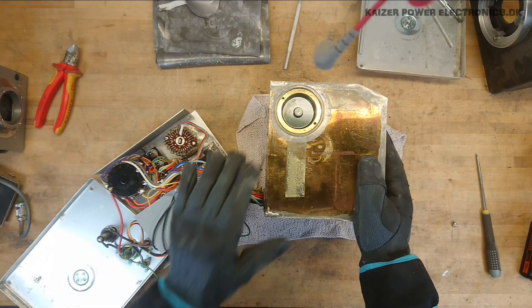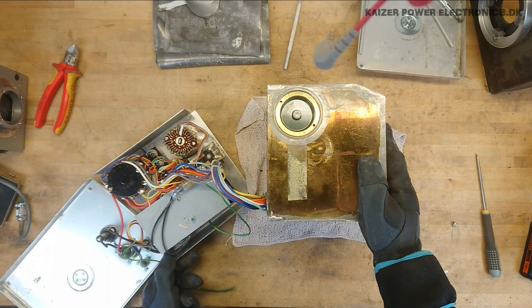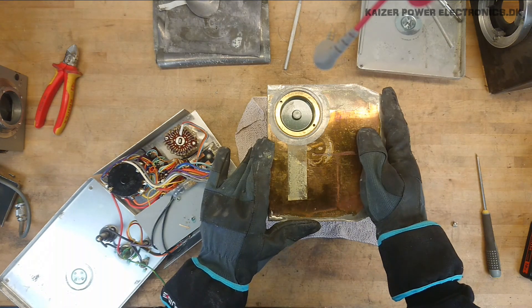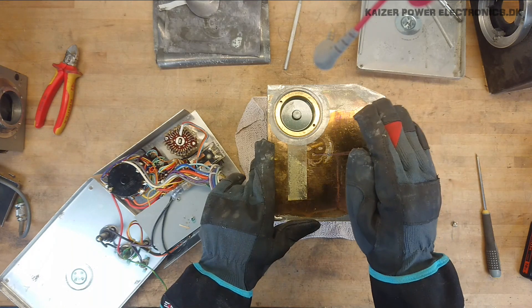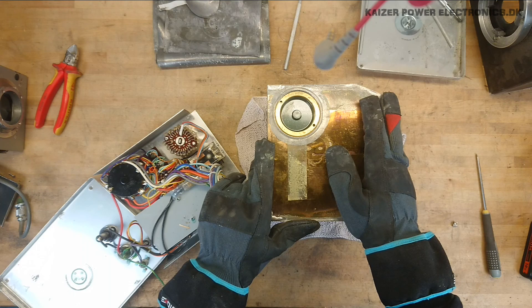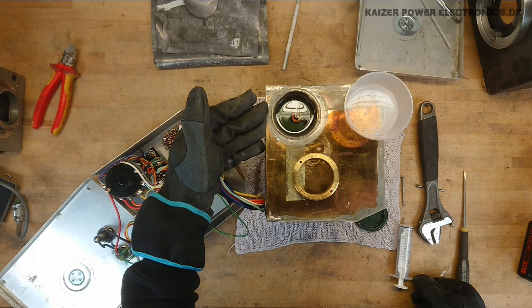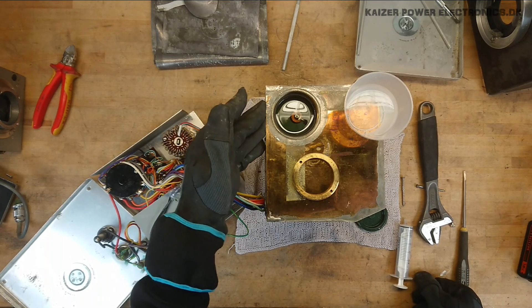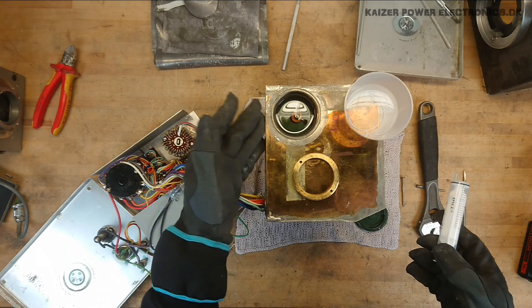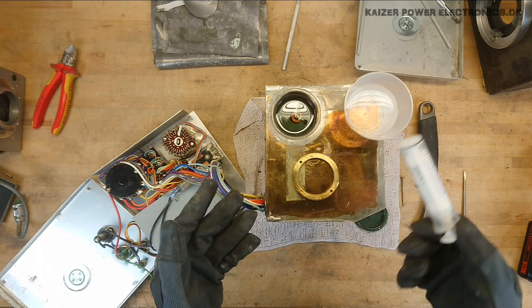Judging from the age of this, I didn't really find any date marks on the inside here. But I do not think it contains PCB oil. I guess we'll have to do a test once we open this up. Upon opening the port, it is clear that this is the oil filling port. To test if this is really PCB oil or mineral oil, you can do a simple float test with regular water.